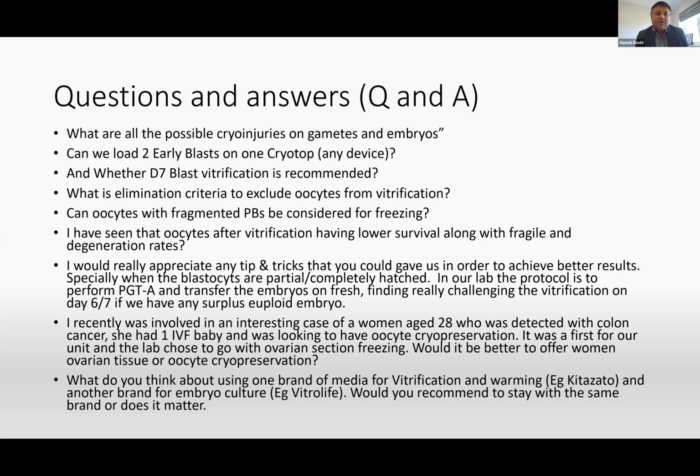Can we load 2 early blastocysts on one cryotop? Yes, you can, but it's only if you want to transfer both of them back. Otherwise, we recommend that you freeze singly. And whether day 7 vitrification is recommended, as I said, yes, we do this clinically, and we've had pregnancies as well.